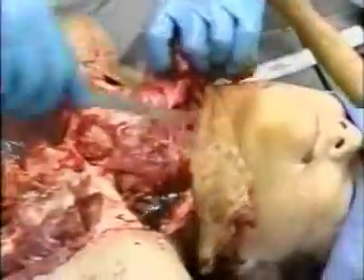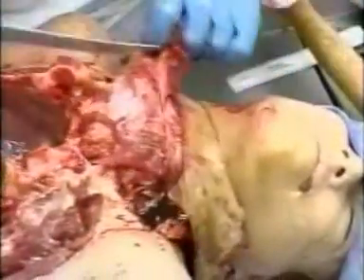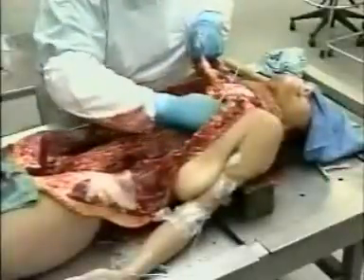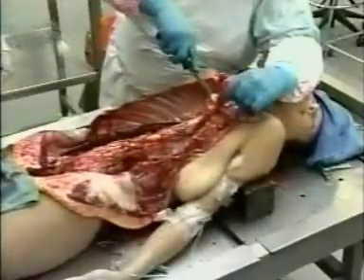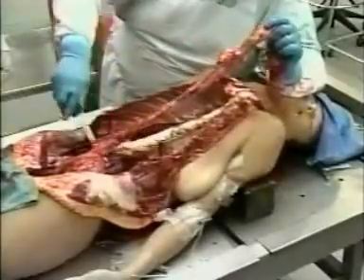He's going to free up all of the tissues through to the base of the tongue, and then dissect down along either side so that the neck organs can be removed along with the tongue. Now that he's down in the upper chest, he can transect them because that leaves enough room for them to infuse embalming fluid through those vessels down low.